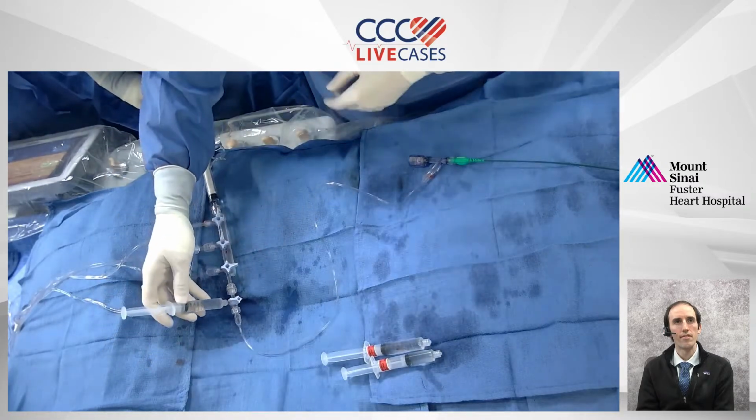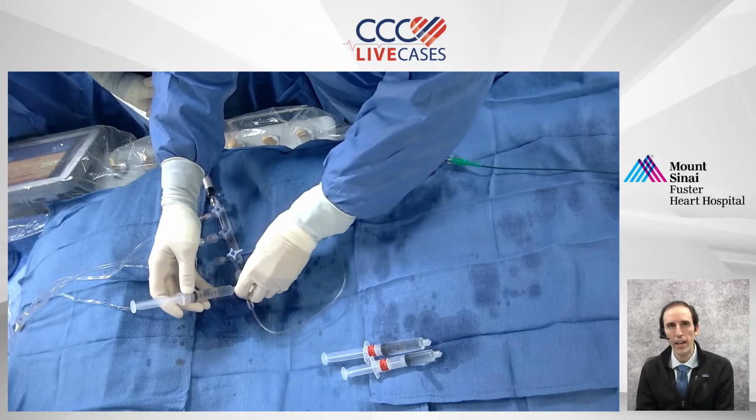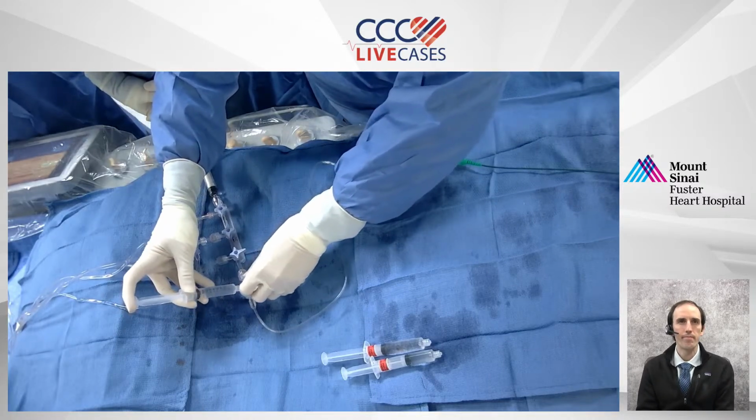I don't know if you're able to see that, Nat. Yep. We can't see the 12 lead ECG right now. Okay. It's coming now, yeah.